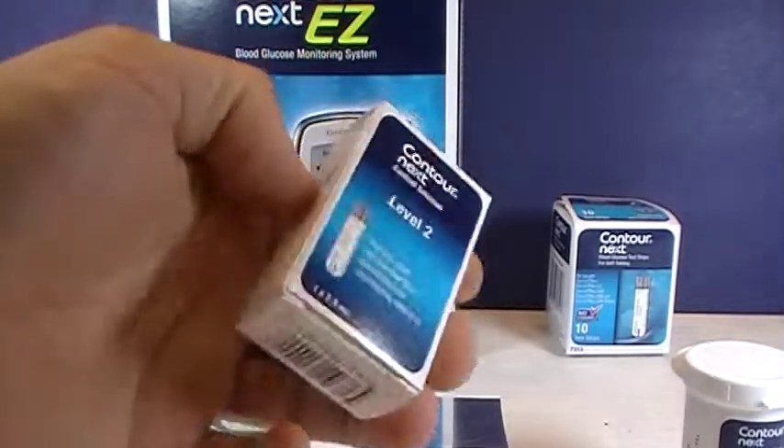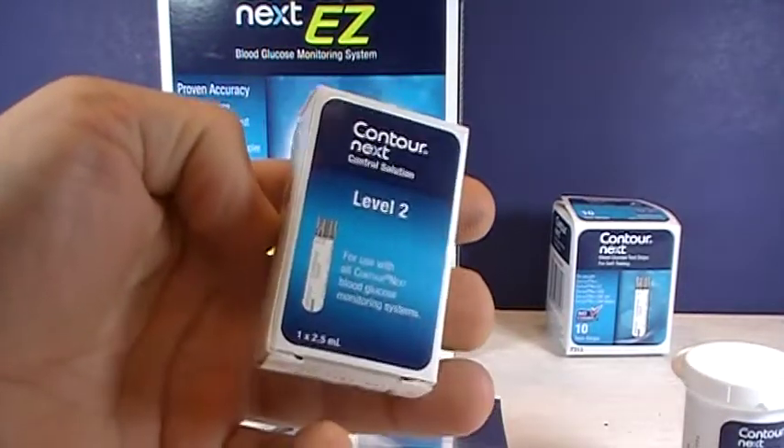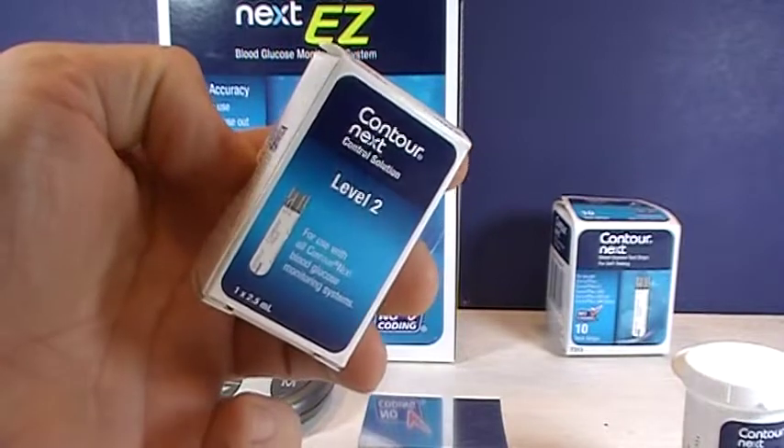Hi, this is Josh, pharmacist with pharmacisttips.com. Today I'm going to show you how to use the control solution for the Contour Next meter.